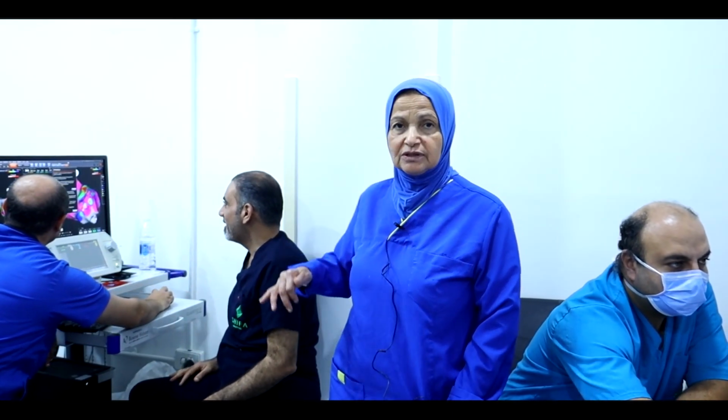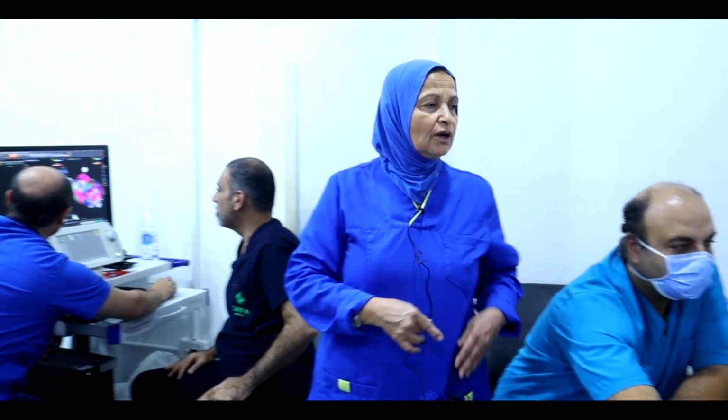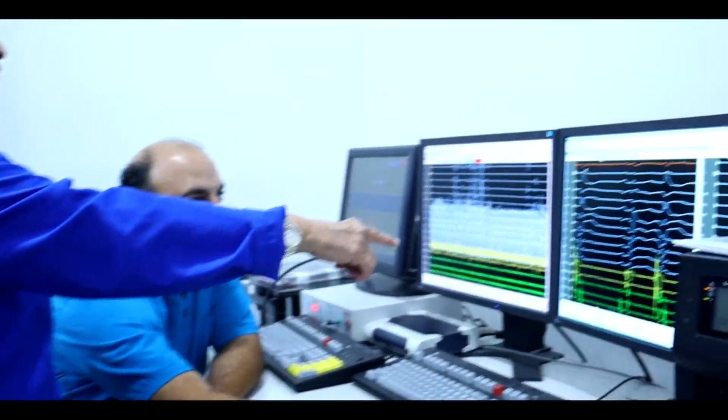Dr. Anwar and Dr. John will explain what happened in this session. In this session, we looked for a voltage map in the anterior surface of the left ventricle. Anwar will show you what we found. And here, before we start, give us the 12-lead ECG, Dr. John.